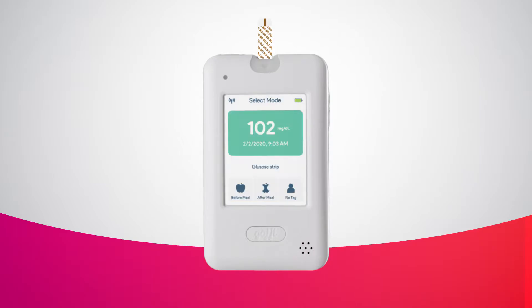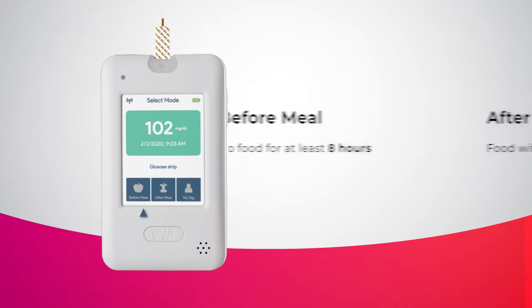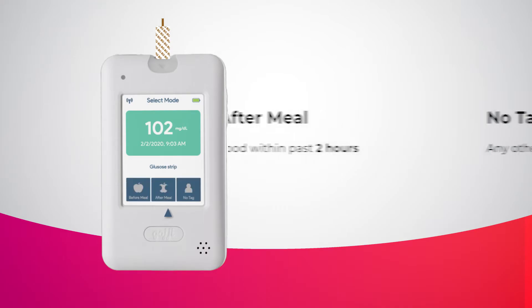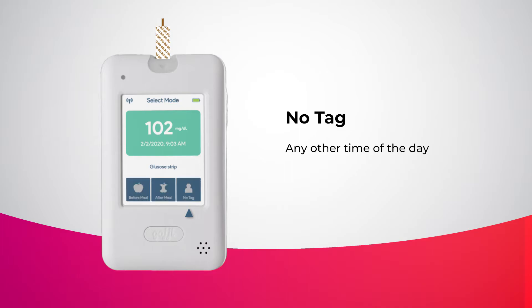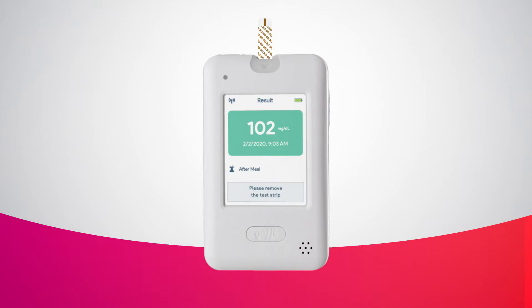After about 5 seconds, your blood glucose level will be displayed in color-coded format to indicate the range of your values, with yellow representing low, green representing within range, and red representing high. Then select the appropriate meal time tag. Tap before meal if you haven't eaten any food for at least 8 hours. Tap after meal if you have eaten food within the past 2 hours. And tap no tag for any time of the day without regard to time since last meal. The result will then be stored in your meter.